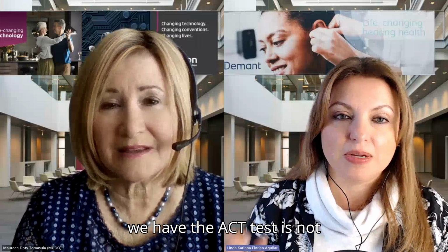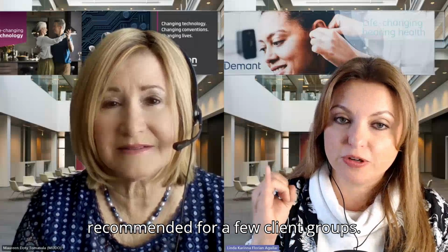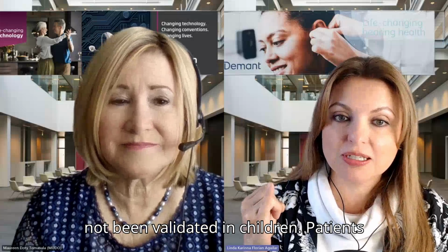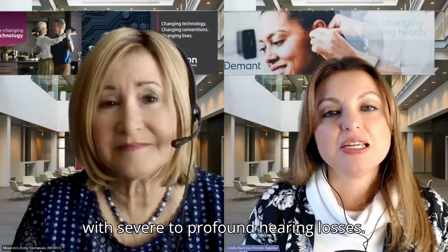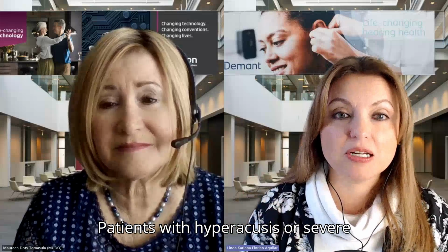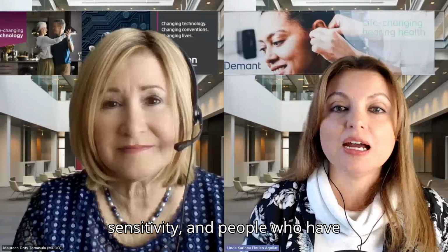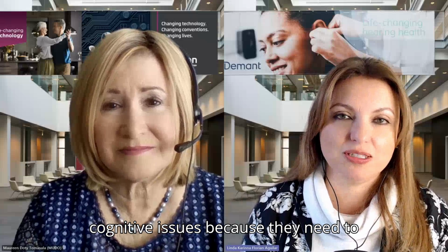Okay, now we have the ACT test is not recommended for a few client groups. First, children. The test has not been validated in children. Patients with severe to profound hearing losses, patients with hyperacusis or severe tinnitus due to sound sensitivity, and people who have cognitive issues because they need to concentrate.